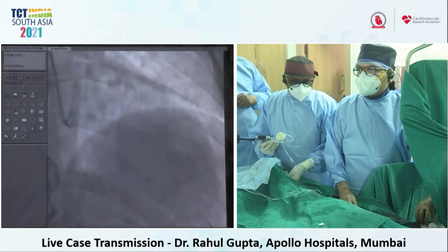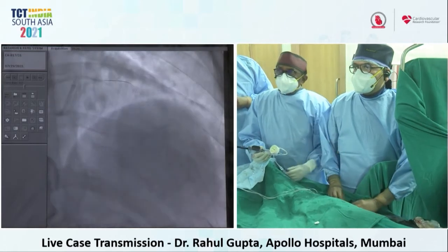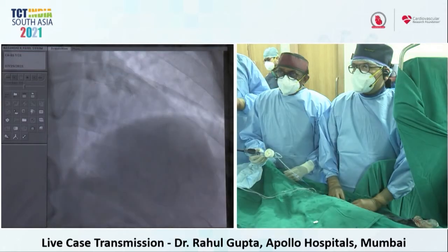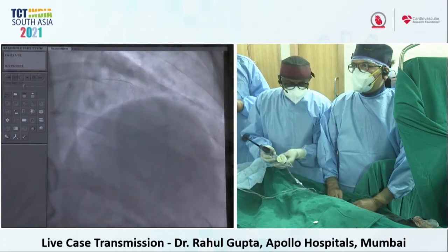But personal experience has been that the incidence is higher, because probably we are stretching the smaller arteries a lot more when we use a sheathless system and use a 7 French or even a 6 French in many of the arteries, because the average artery is pretty small, 1.7 to 1.8 in the Indian population.